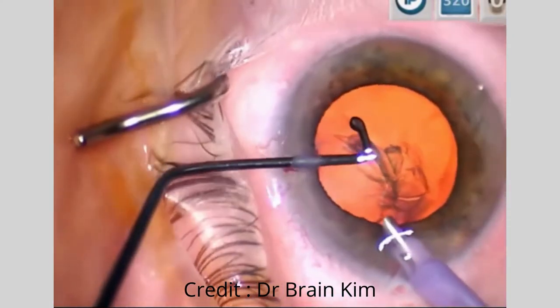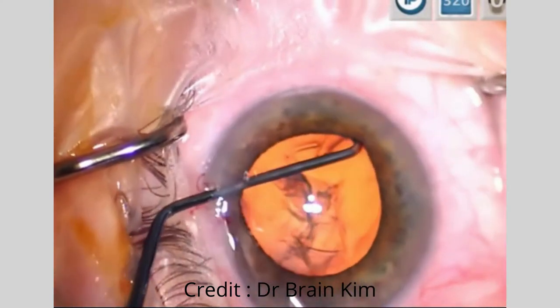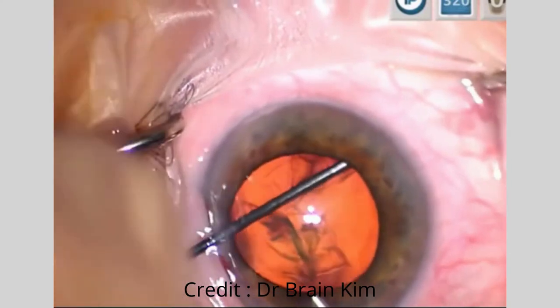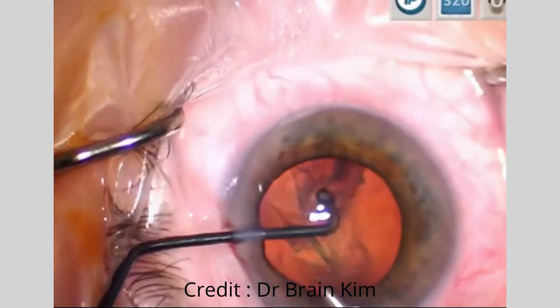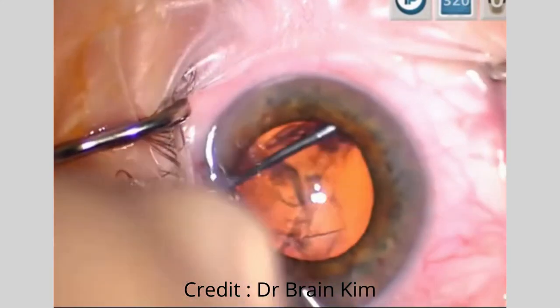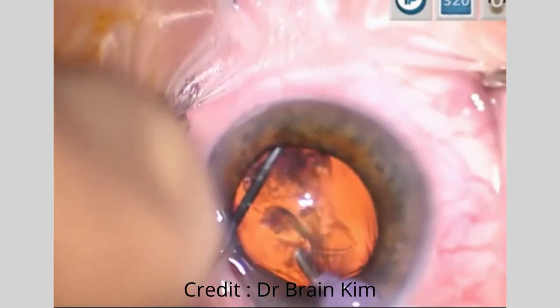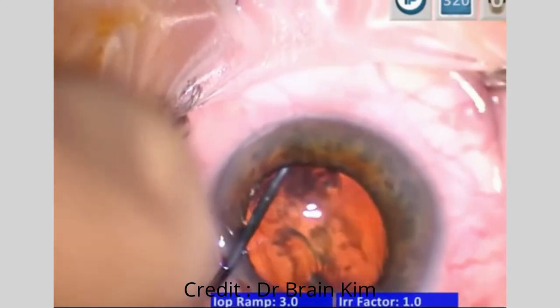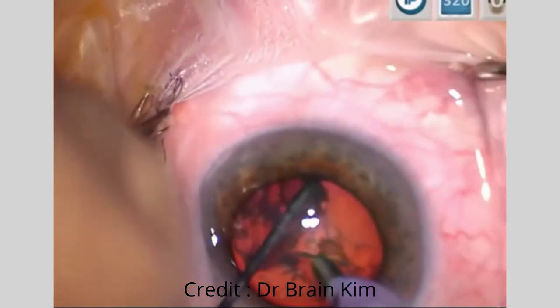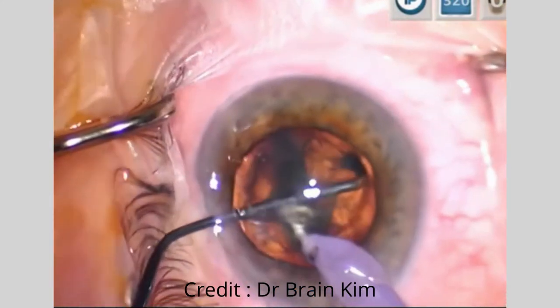The pronation and supination move is the same for the cross chop. This is a final illustration to show that you don't have to see what you're doing, because you know where you are. Push down the epinucleus material, get under the anterior capsule, glide out to the equator, supinate, and you're in position. You saw me nudge the lens to show that I am indeed in the equator, because as I nudge, the lens moves within the horizontal plane. If I was not in the proper position, the lens would be tilting, or I would simply be scratching the surface.